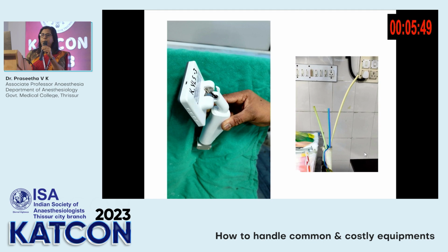So this is a common situation that we see, especially with your difficult airway adjuncts like bougies or tube exchangers. They have been stored in a very unhygienic and bad manner. Whenever possible, store them in the containers designed for them. If you keep them exposed and then put them into the trachea of a patient, you transfer infection, and the quality of the equipment will also be lost. These are very simple things, but I took them randomly from our OT.